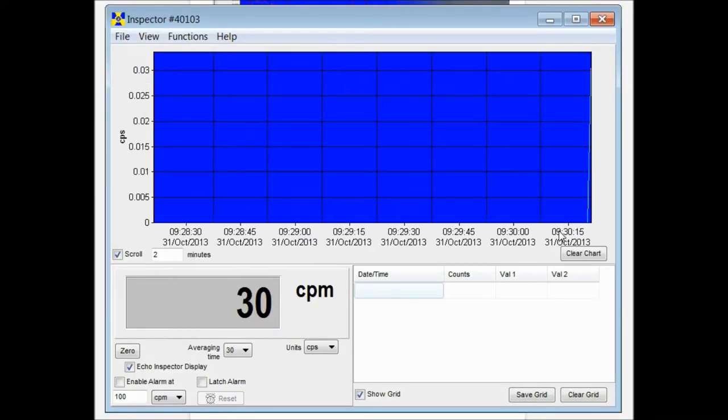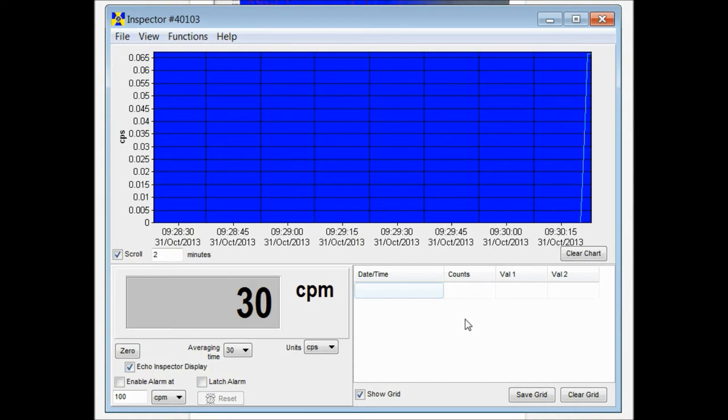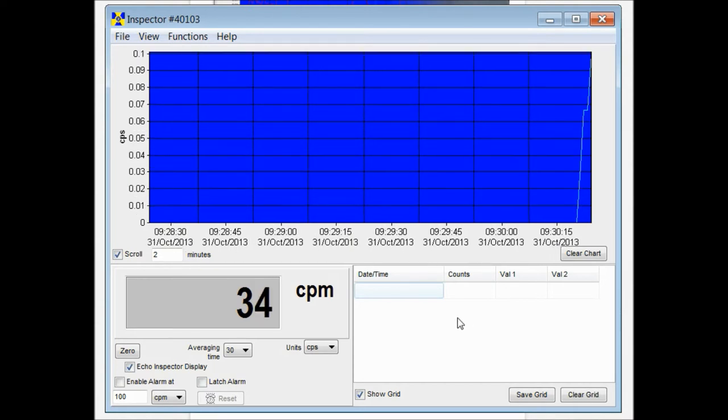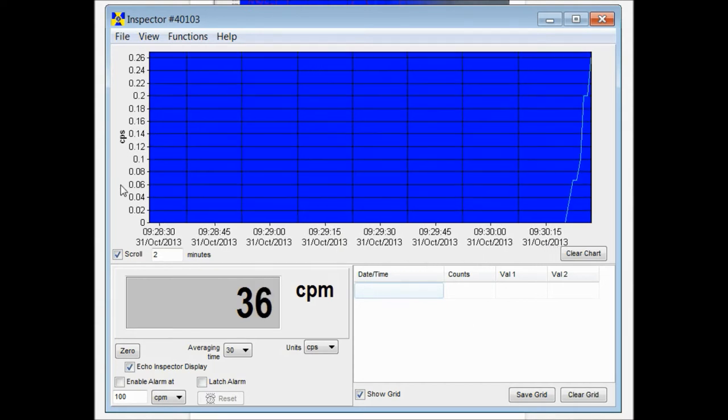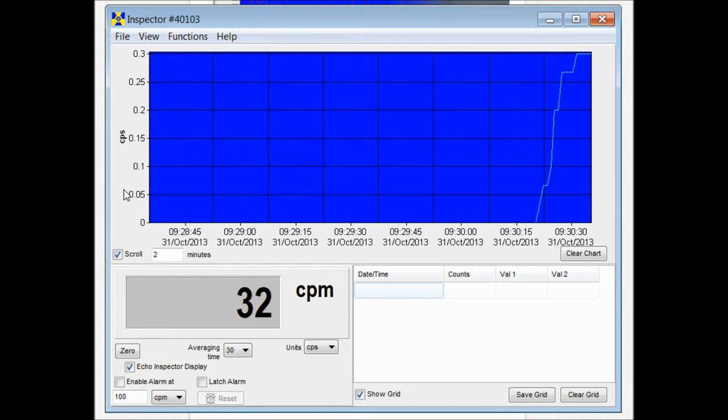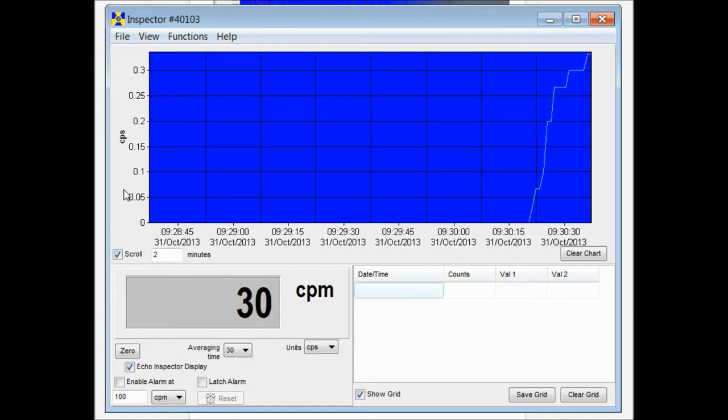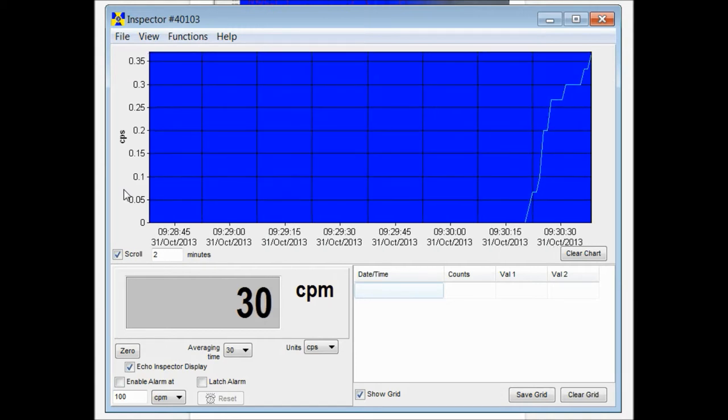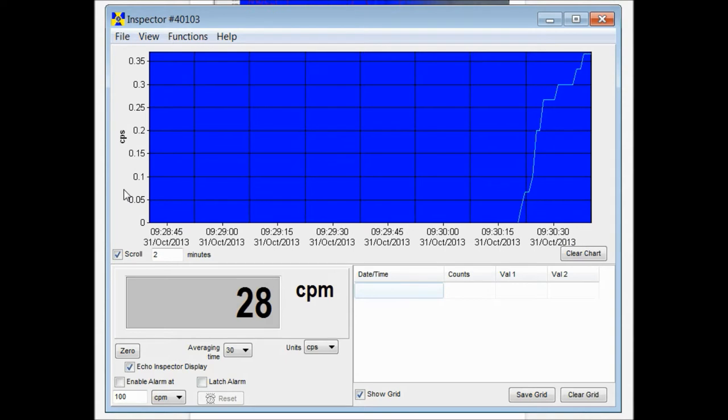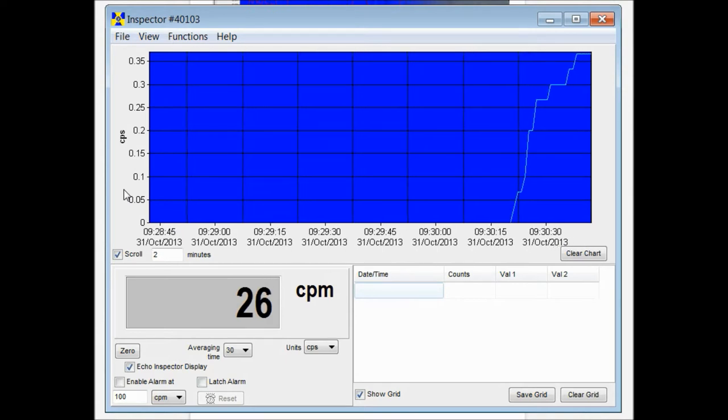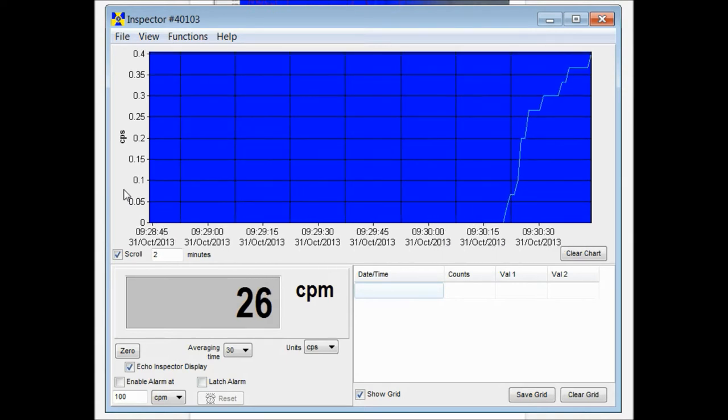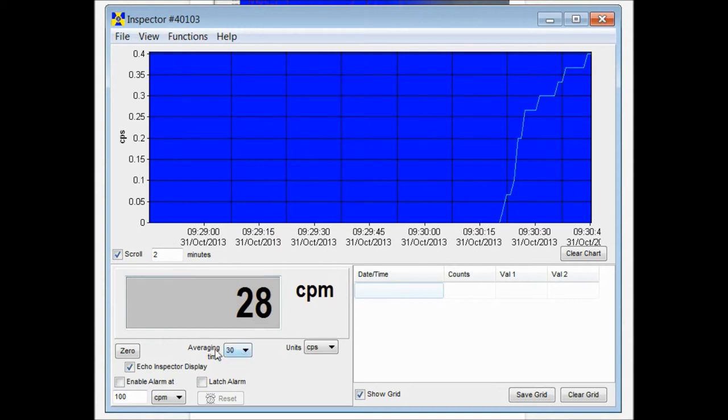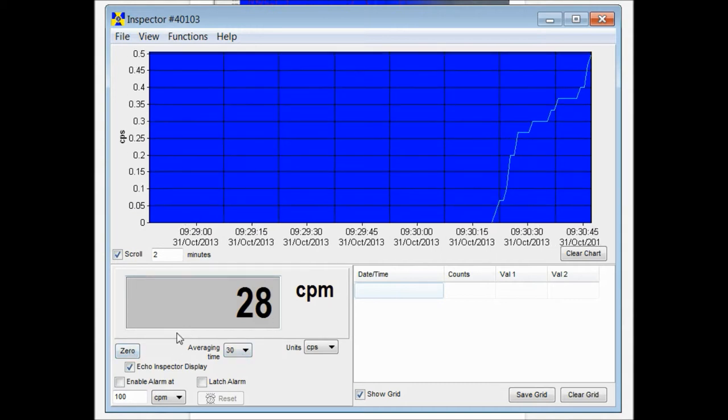The USB window will launch here and you'll start to collect readings right away. The software offers a few different functions. You can download the data off of your unit, change the settings on your unit, or just collect the live data that it's recording. You can zero out your recordings.